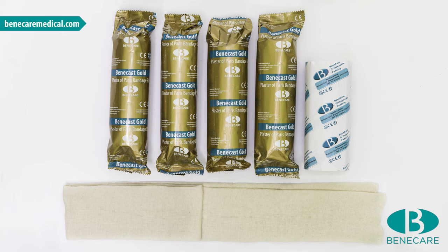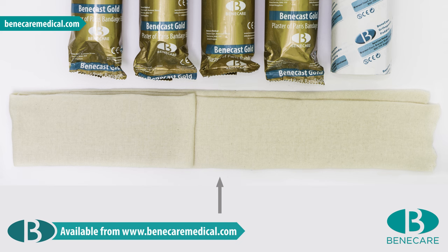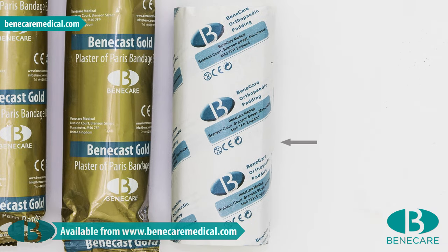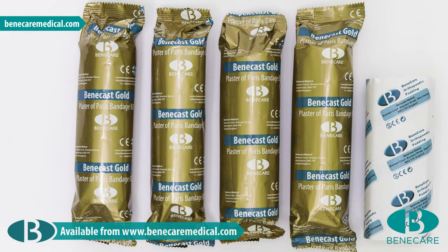The products required include 1 piece of 7.5cm Benecast stockinette, 1 roll of 15cm Benecast undercast padding, and 4 rolls of 15cm POP Gold.